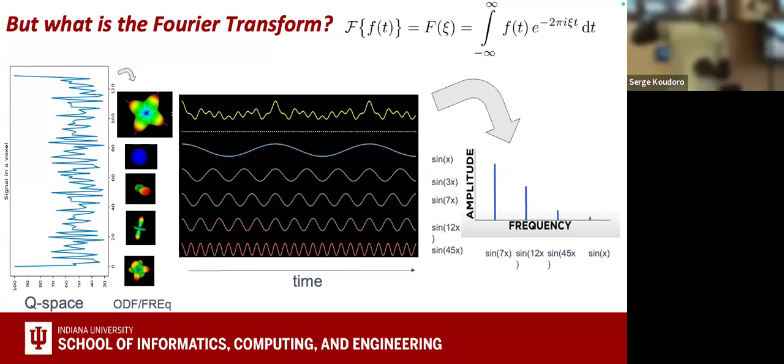The signal width. So here, imagine that this is a signal of one single voxel, of course. So you apply it to all your voxels. You have your signal for every gradient strength of your voxel, okay? You apply this FFT on this diffusion domain, and you have the new representation which represents your ODF that you have here, and this ODF that we call a spherical function can be described in multiple spherical harmonics.